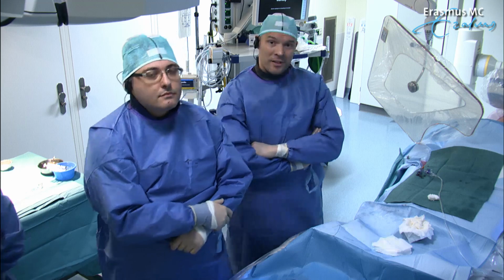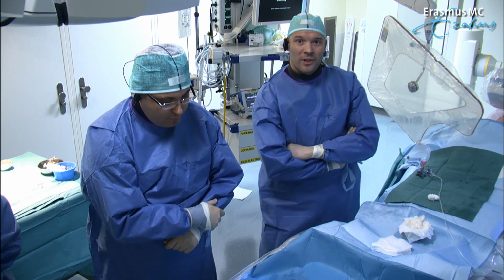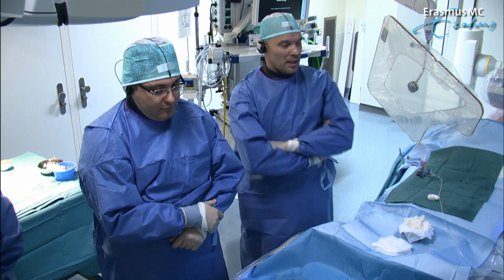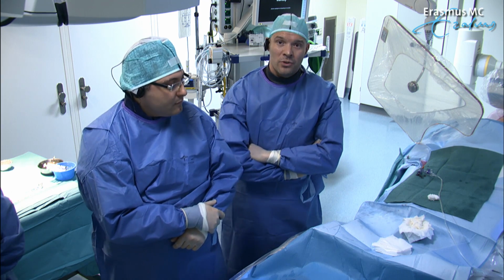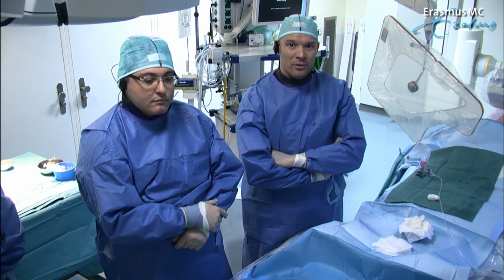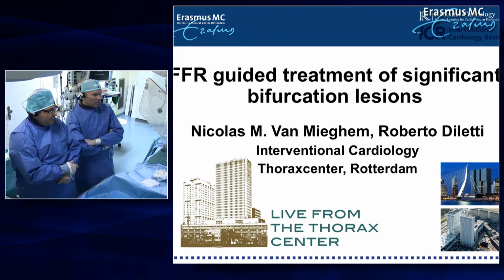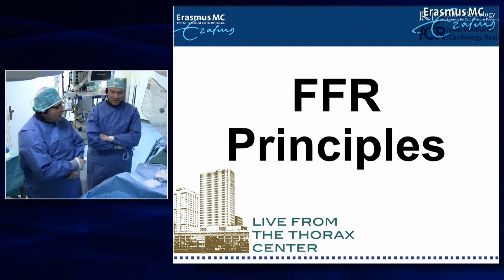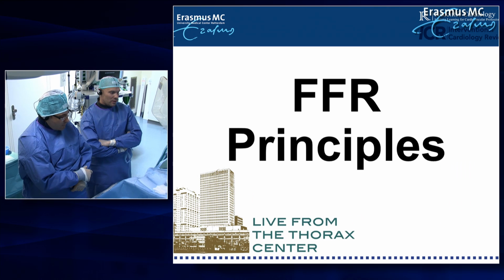So the aim of these live cases is to demonstrate current technology in real practice. And for today, we want to show you bifurcation stenting, but also the use of FFR with bifurcations. So maybe, Roberto, you can give us some feedback on FFR and tell us what we're going to demonstrate today.